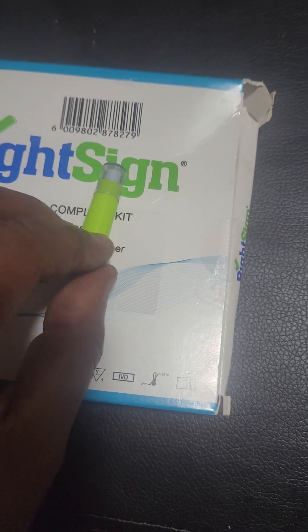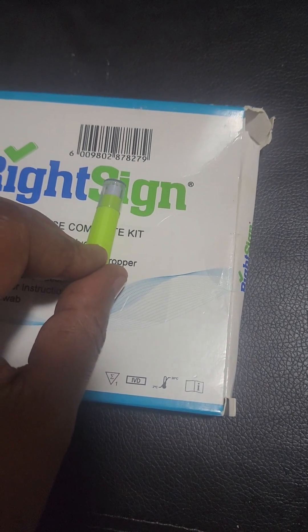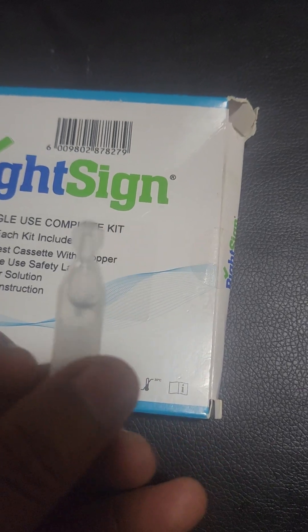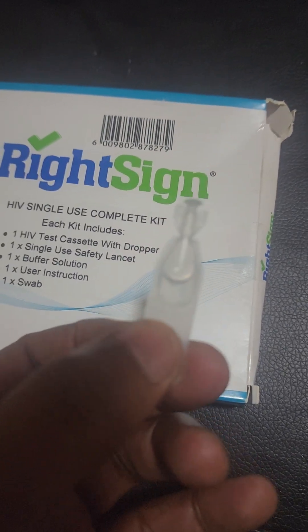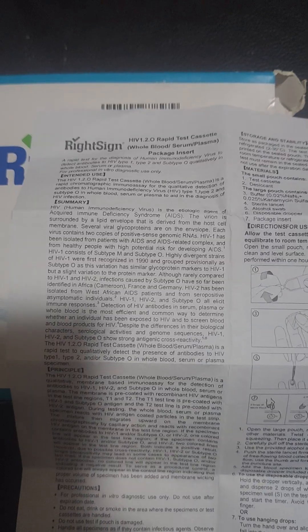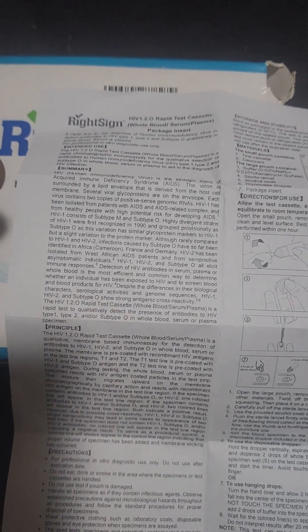The lancet is what you will use to prick yourself. The buffer solution is what you will then use to dilute your sample after you put it into the test cassette. The instruction manual contains important information on the test, the principle of use, and its precautionary notes.